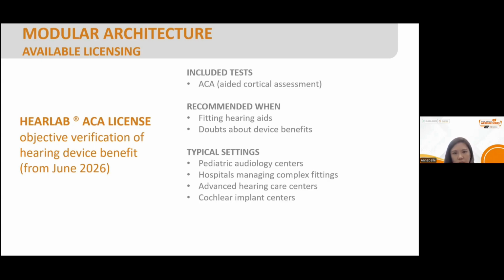You fit the hearing aids and you still want to check objectively because they can't really tell you whether they can hear or not, then you do the HEARLab ACA license. Okay.